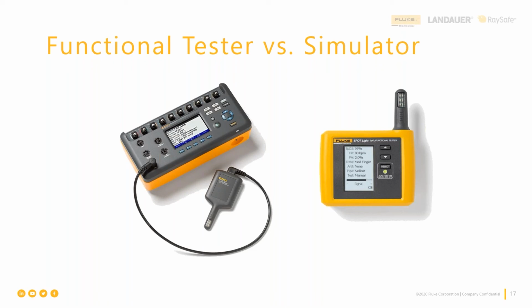Because they say in order to simulate it, one would have to produce an actual technical equivalent of the human physiology, not just the electrical signal and the optical signal. That means you would have to have some chemistry going on in a tissue equivalent, a blood equivalent fluid or something, in order for it to be a true simulation. Well, that's not what we're producing. That's not what anybody is producing.